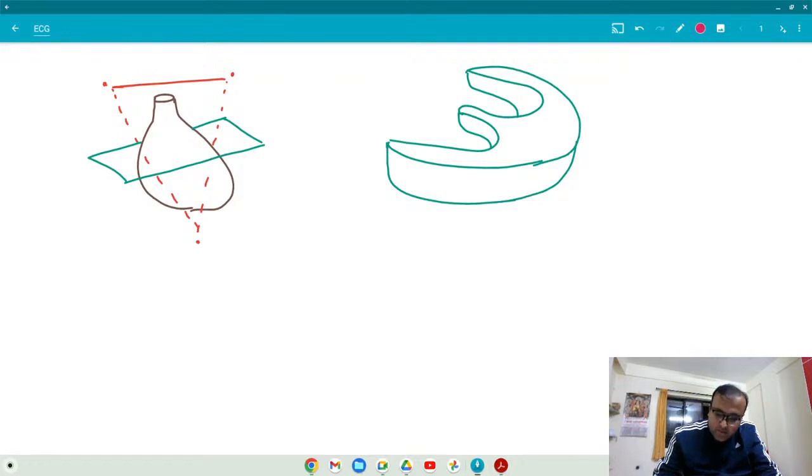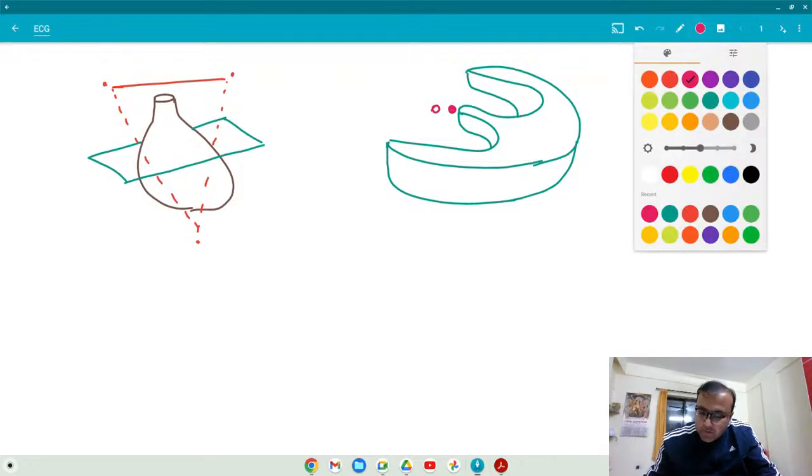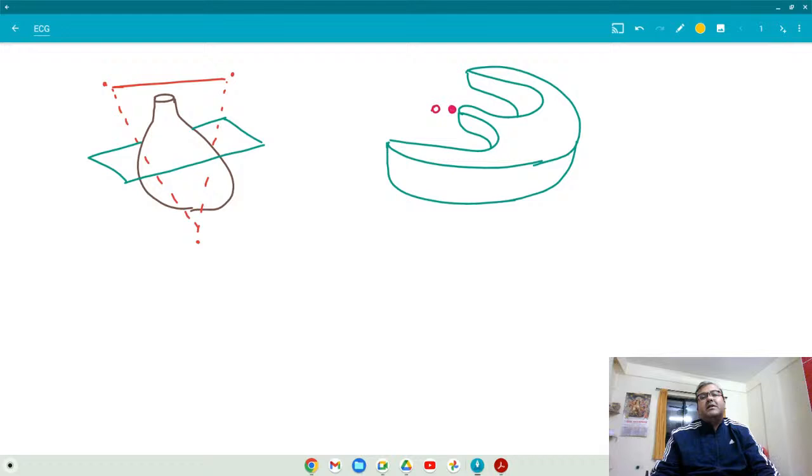Okay. That means this is zero. This is the zero position. Now my point is this: I want to check the potential difference between the center point and this point, center point and this point, and so on. Tell me whether you understand it or not.